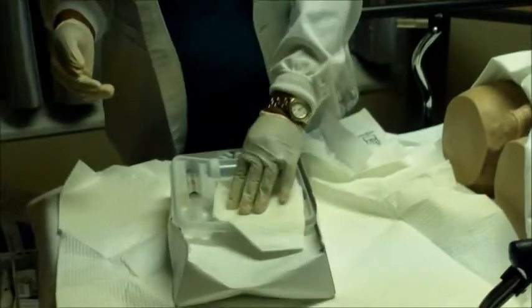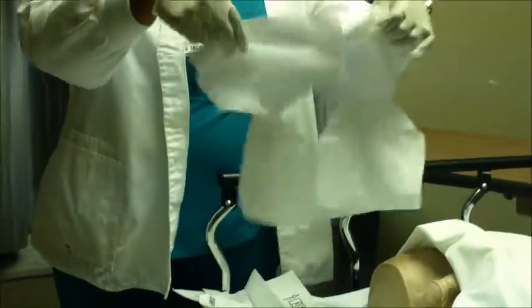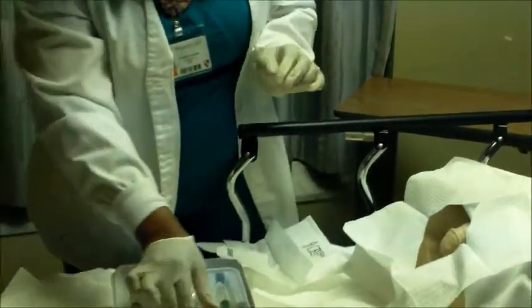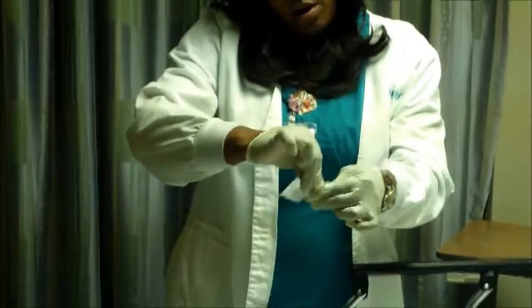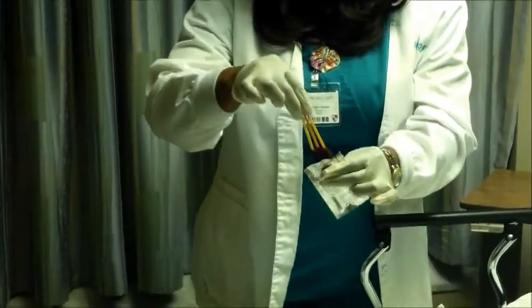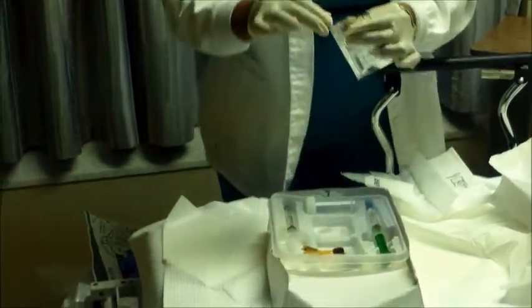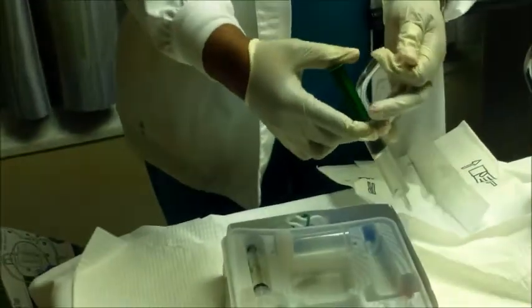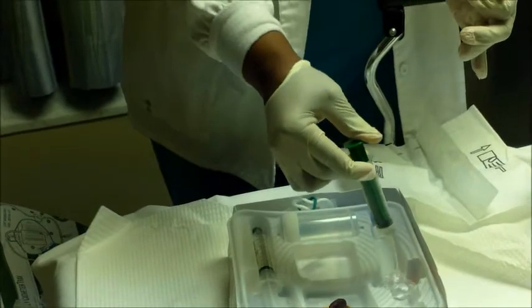Okay, now I have a drape. Now, I have my betadine. I want to open it, dispose of it, and go ahead and pull these 3 out. I have my lubricant, which I'm going to squirt in the tray.